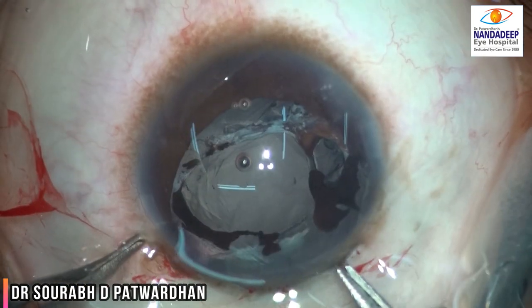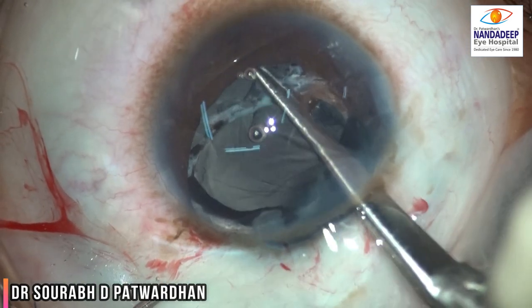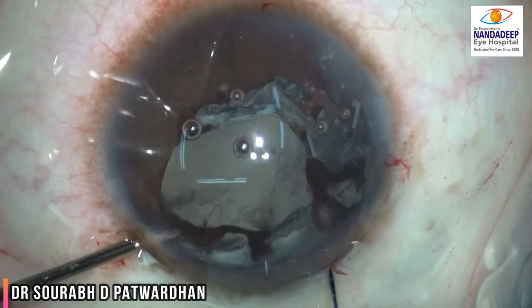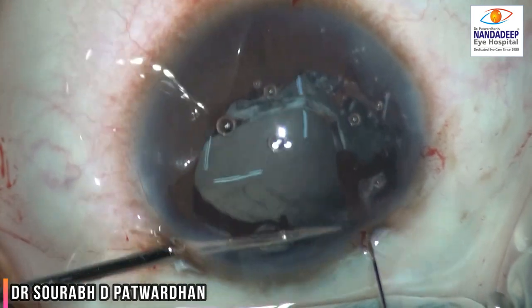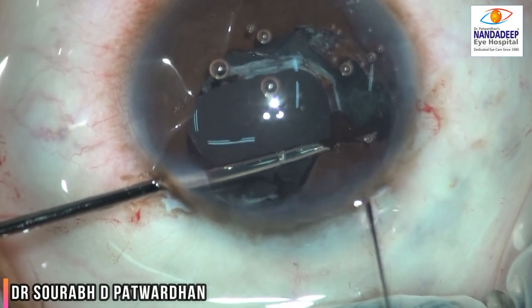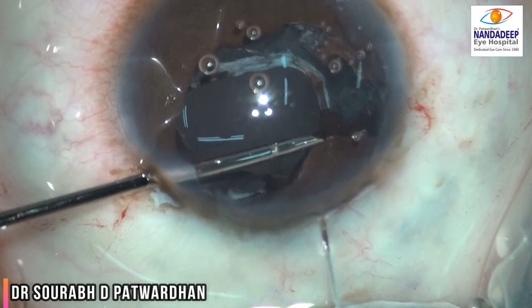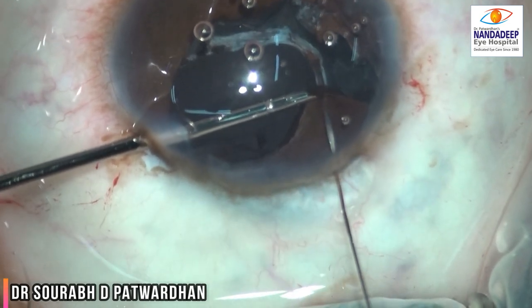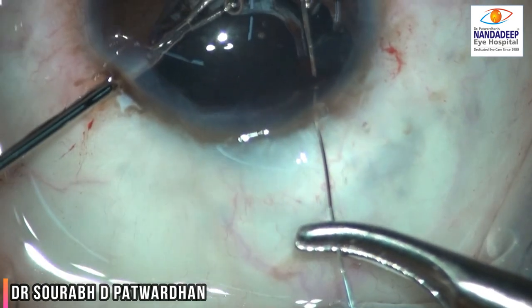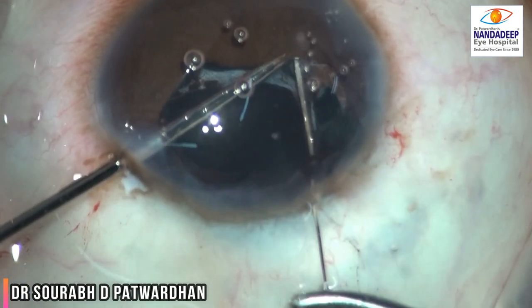Under viscoelastic cover, I removed the IOL and released the synechiae between the iris and the anterior capsule. I realized that the bag or the anterior capsule didn't have adequate support and was also subluxated. So I decided that I had to create the pupil first. I found that there was a superior bit of iris which had become atrophic and shrunken, so I decided to do a pupilloplasty.